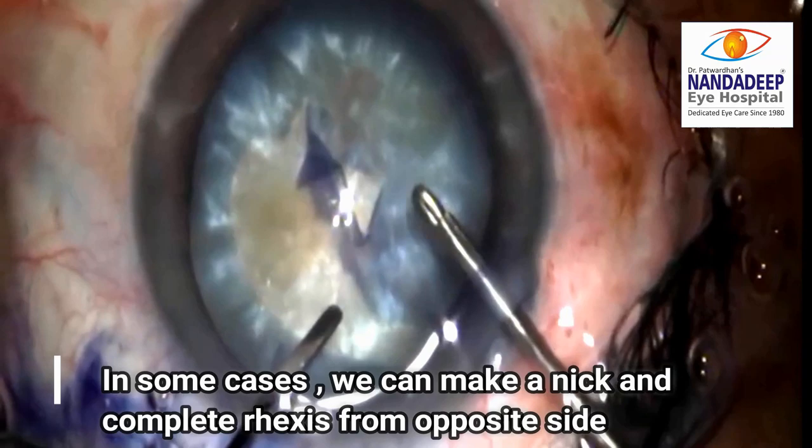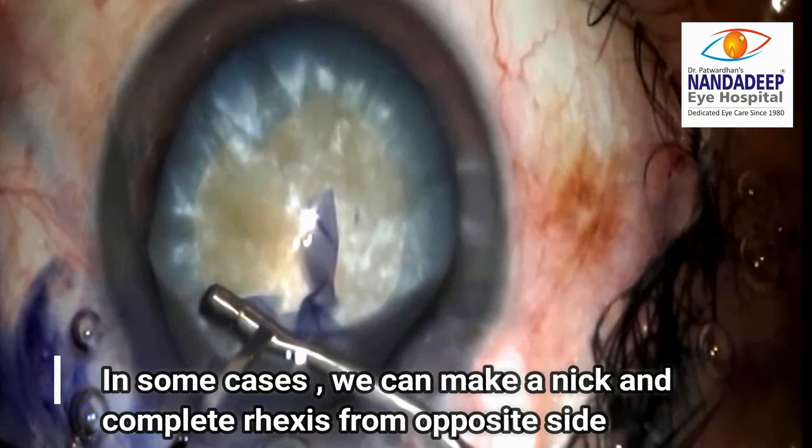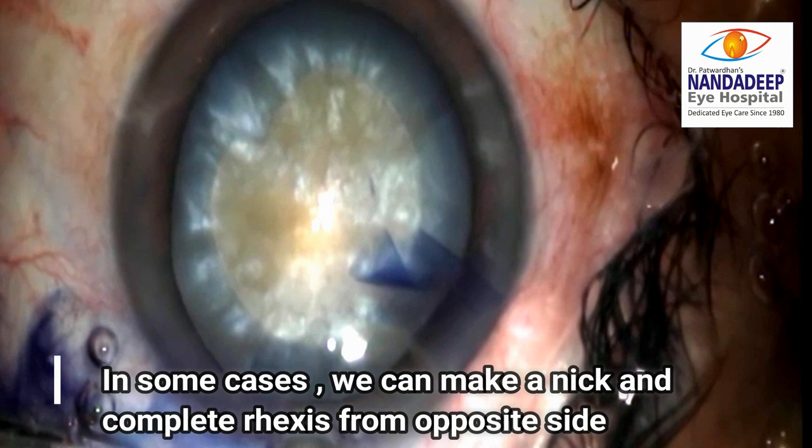In such cases, the surgeon has an option of completing the capsulotomy from the opposite direction. However, such a rhexis is a weak rhexis and it can lead to potential complications during the phacoemulsification.